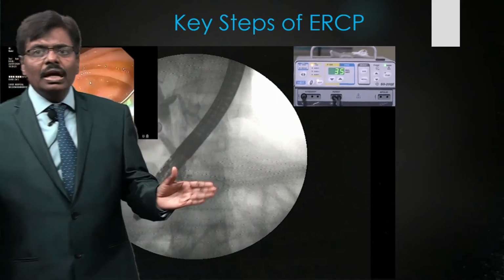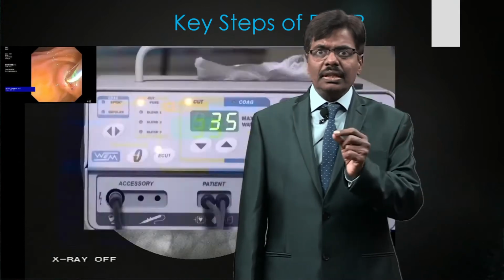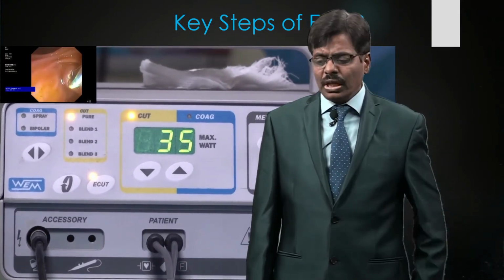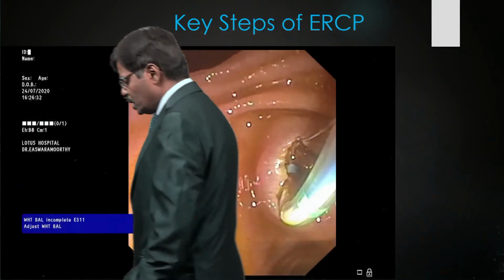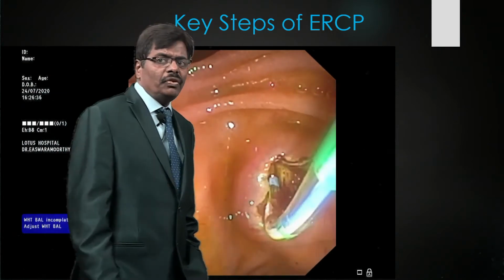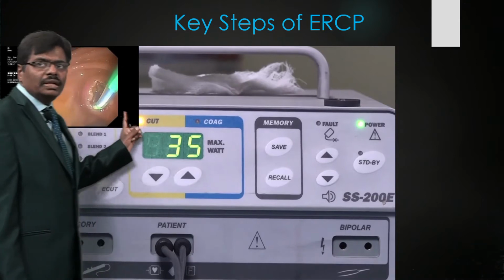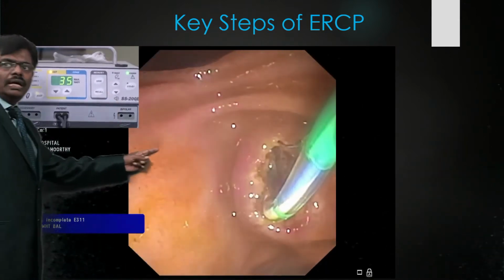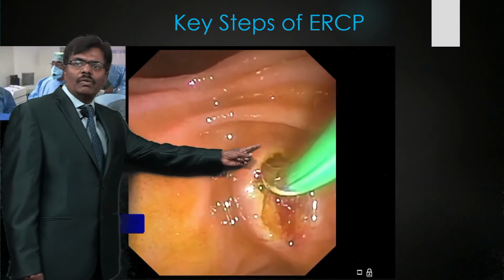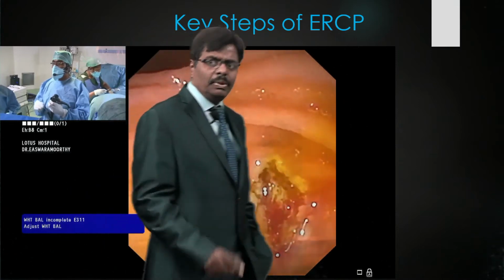There is an effect endocut. We have various things available. We have here VEM and other things, but usually around 30 to 35 watts, that's what we go. And very important is control. How far can you cut? If you ask me here, for example, you can't go beyond that. So here, for example, this is the fold. You should not go beyond that fold. I have about 2 more millimeter here. I can cut if you want, but otherwise you can just minimize the cut.